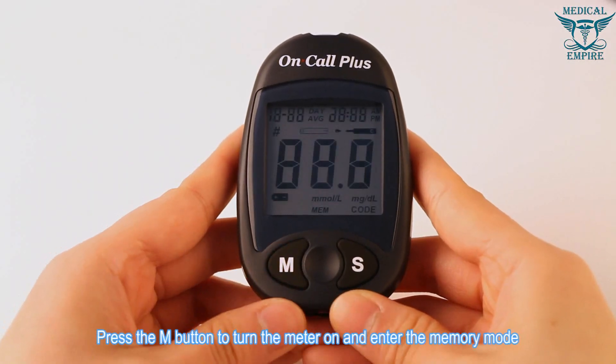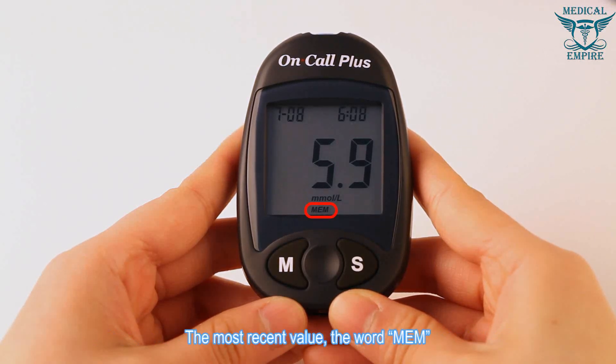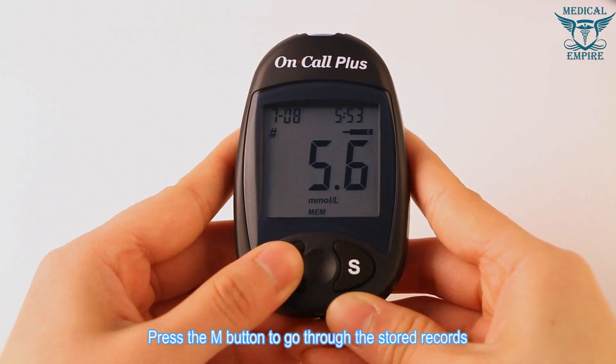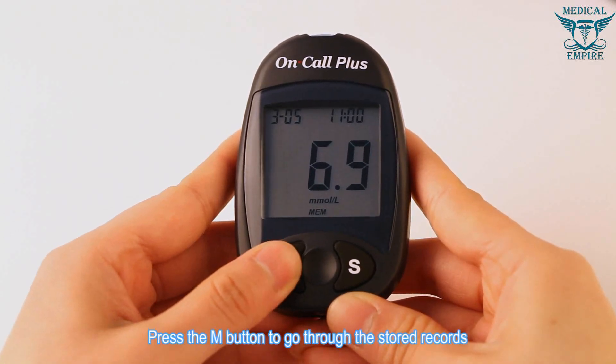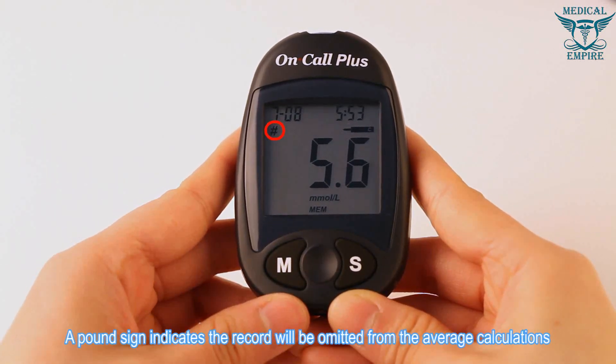Viewing stored records: press the M button to turn the meter on and enter memory mode. The most recent value, the word MEM, and the date and time will appear on the display. Press the M button to go through the stored records. A pound sign indicates the record will be omitted from average calculations.